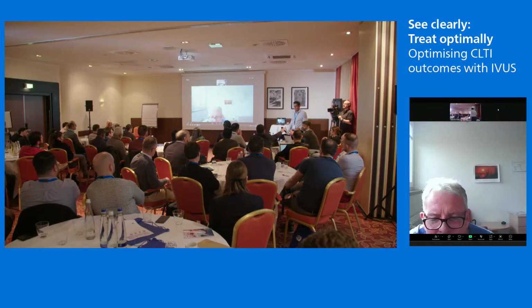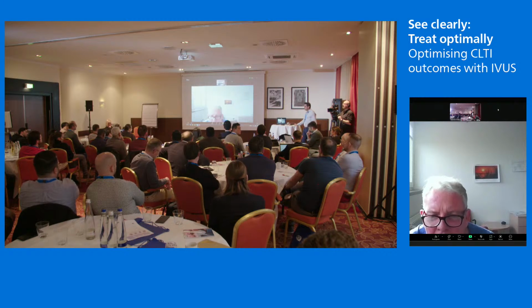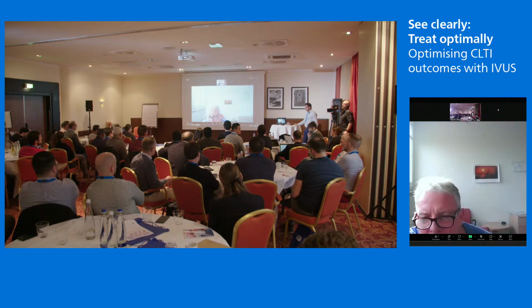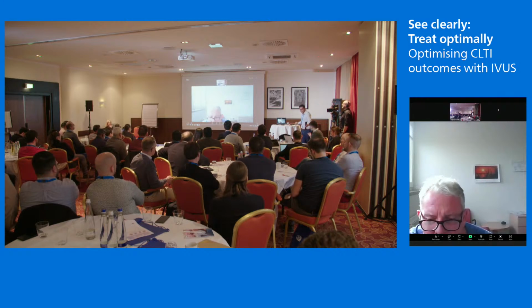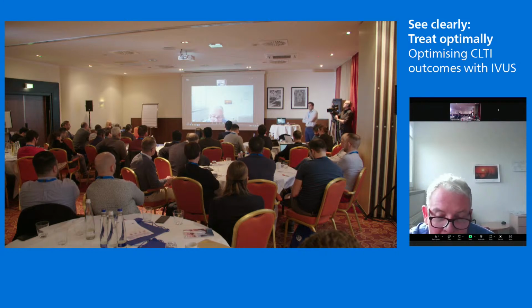I think this is ideal, because if you share it with the cardiology or cardiothoracic surgeons, then it's at least in use quite a lot, and then it's worthwhile to have it. So I think you don't need different equipment. The laser is always the same machinery, so you only have to buy the catheters. That's really easy. And the laser definitely is, for me, for clearing out stents. So if you have full metal jackets in the SFA, which we have in the history done quite a lot and still do, if it's highly calcified, then you can clear out the in-stents, which is quite nice.